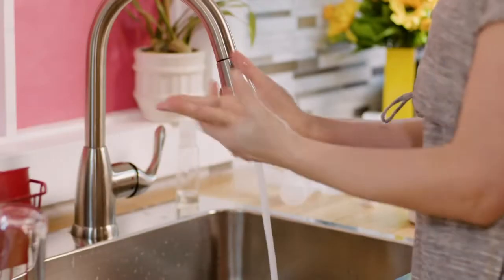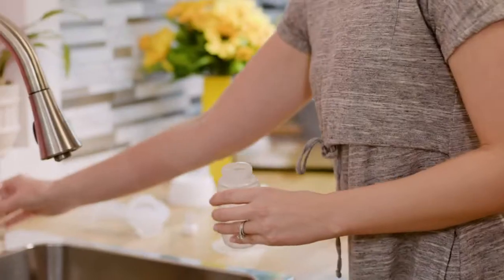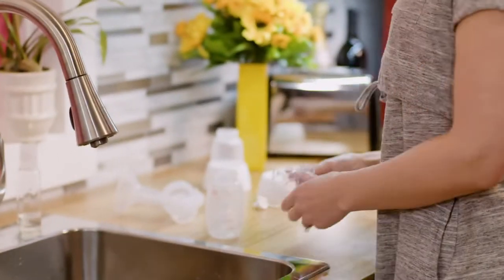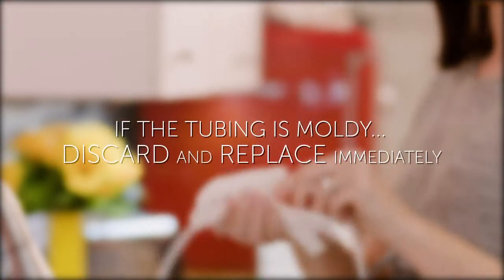To clean before using, first wash your hands thoroughly with soap and water. Closely inspect and then assemble your cleaned pump kit. If you notice the tubing is moldy, discard and replace immediately.